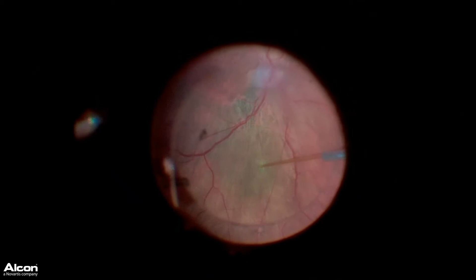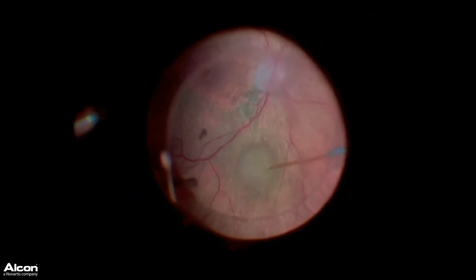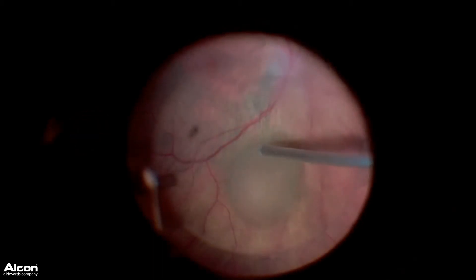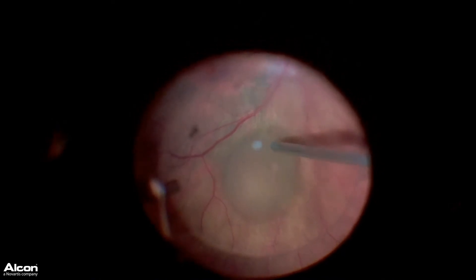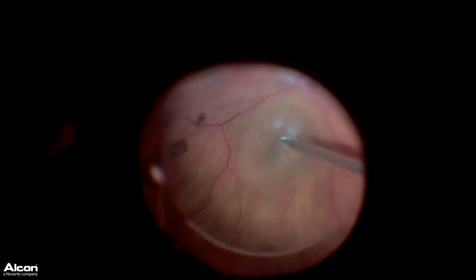We can see here I'm creating a bleb of subretinal fluid utilizing a 39-gauge subretinal cannula on the VFC foot pedal control. I then diathermy just the two vessels leading into this area to try and create some hemostasis and control any bleeding.